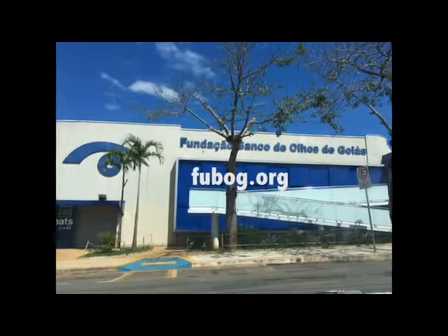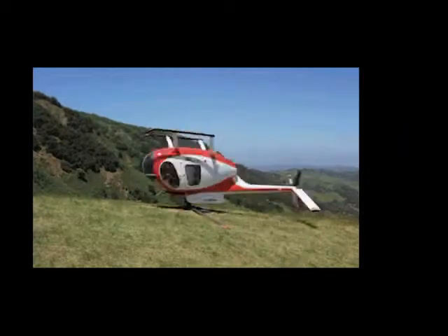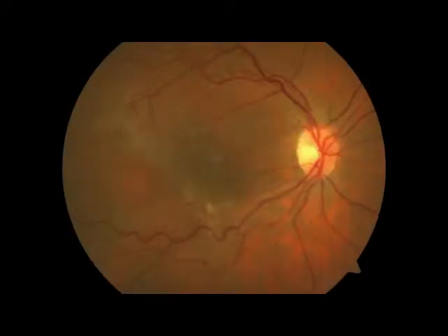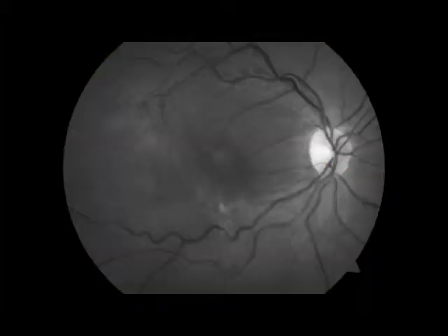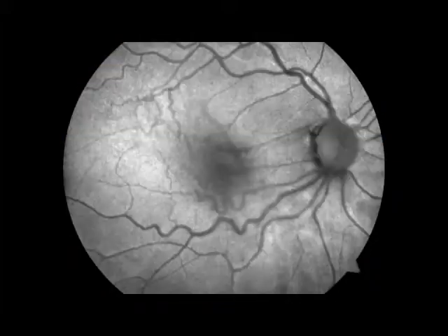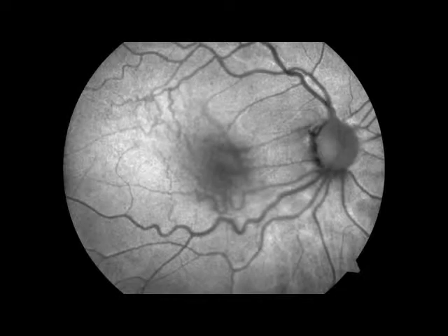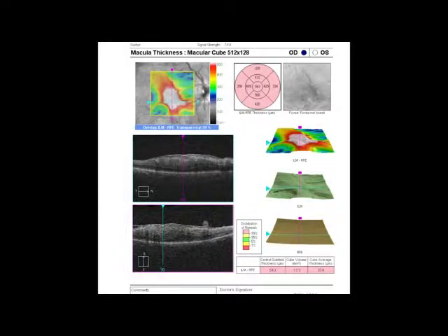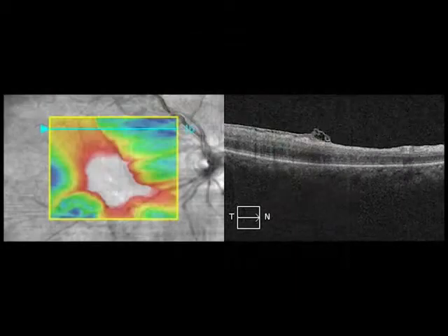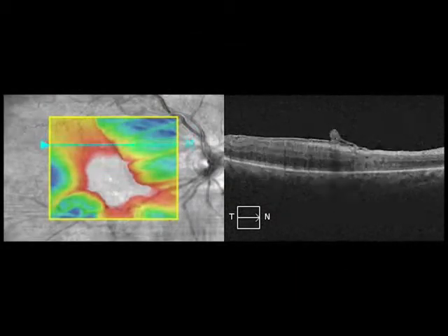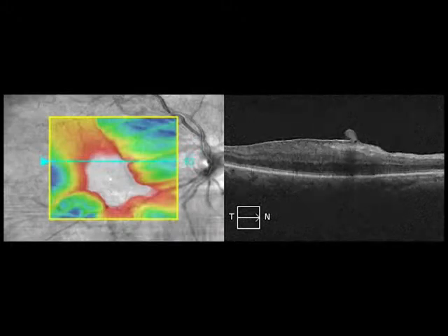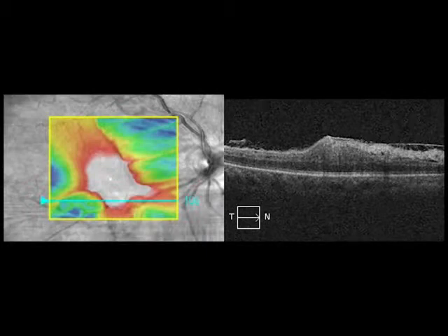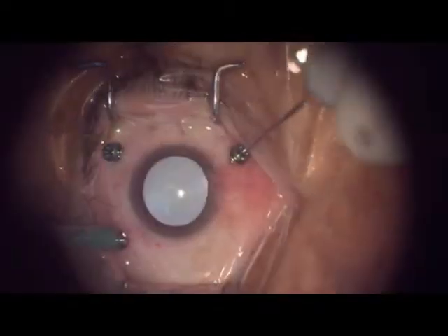This is an inverted vitrectomy epiretinal membrane peel with brilliant blue. These are the OCTs and FAs from the patient with epiretinal membrane. On the movie OCT you notice the epiretinal membrane crossing the macular area and it is full thickness. It also causes a great macular edema due to traction.